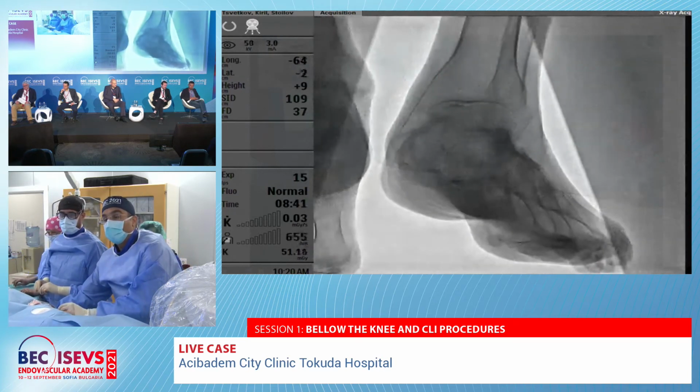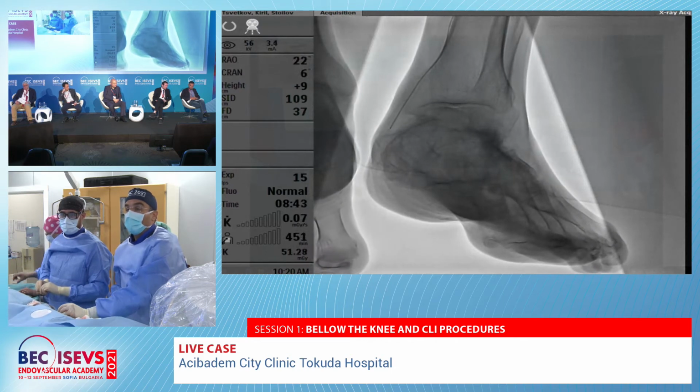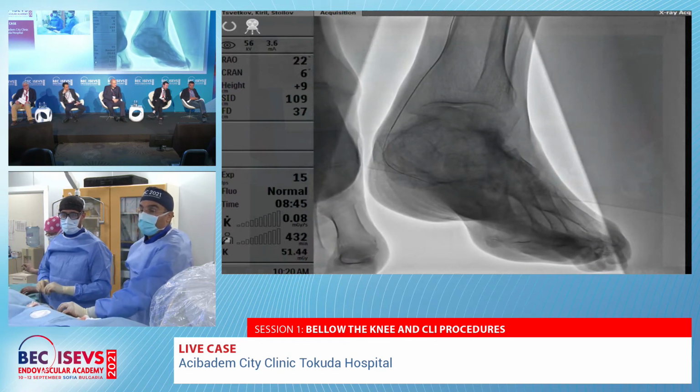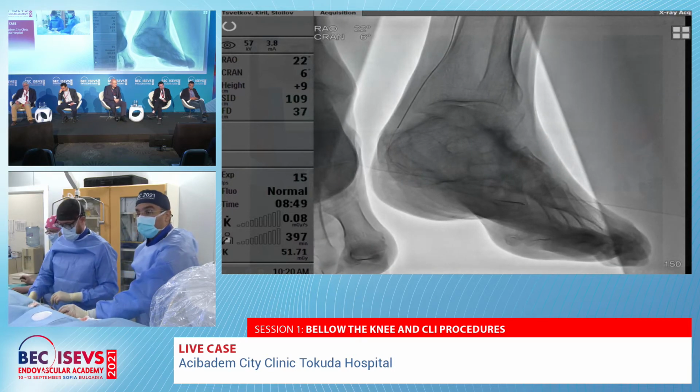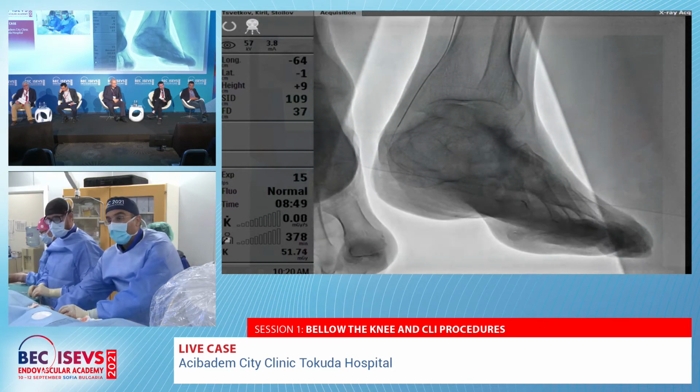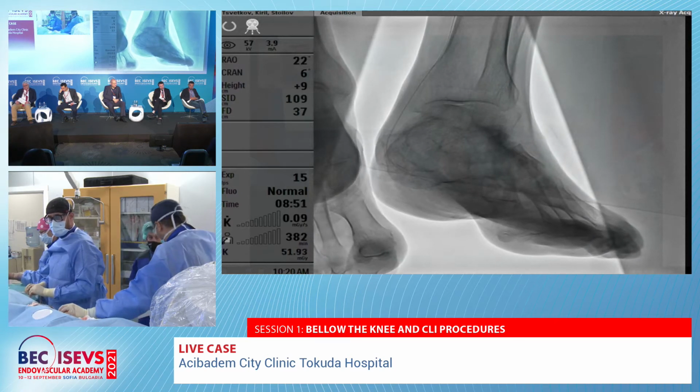Is this a support catheter O35 or O18 or 14? It's 018. Okay, go there. Loop is fine. Okay, you can remove it. Okay. And then we will start. You can open the tube. Perfect.